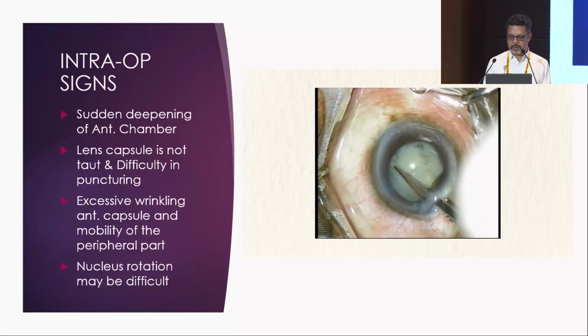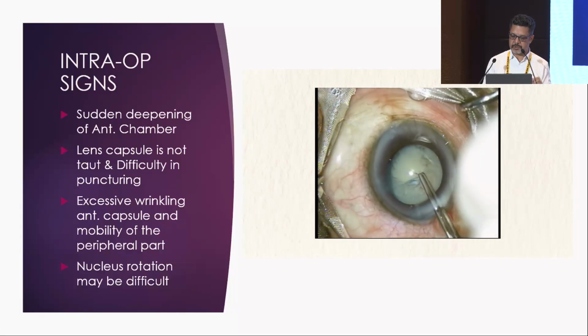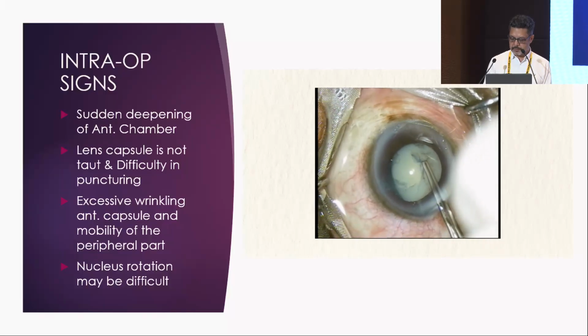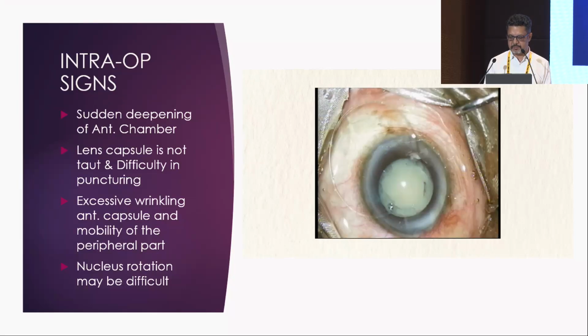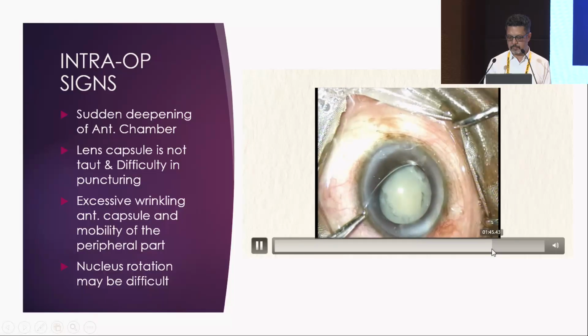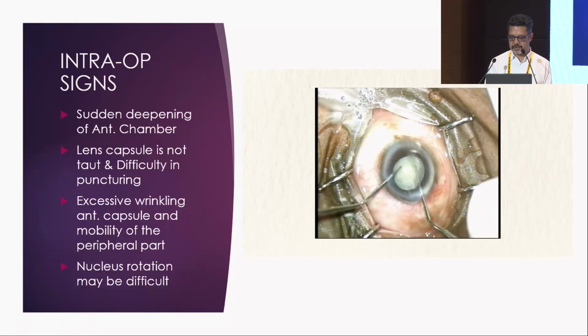There was a fibrosis in the capsule as well, so we made a nick with the vannas scissors, and we could complete the rhexis. After completing the rhexis, do it very gently. So the cataract surgery was done, and again we implanted the CTR and finished the surgery.